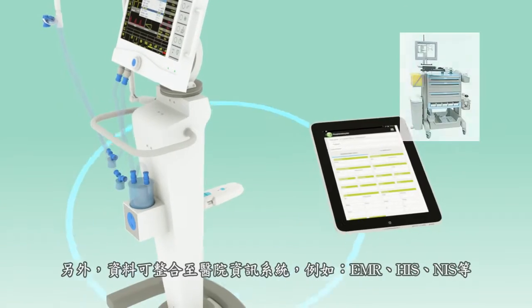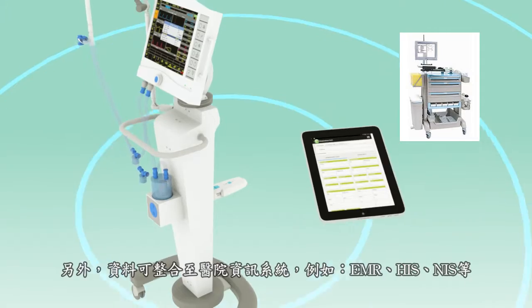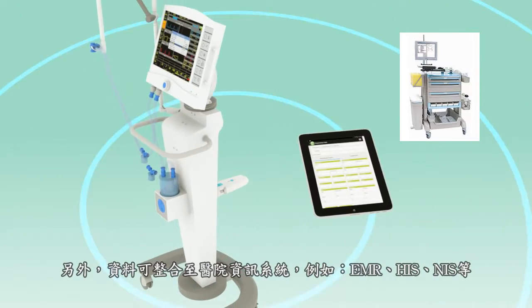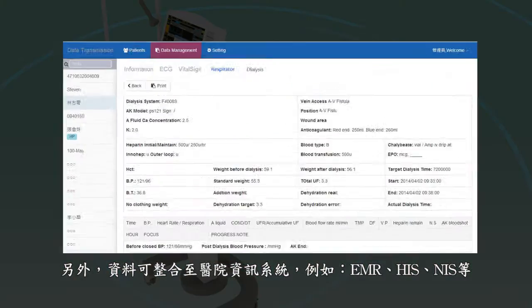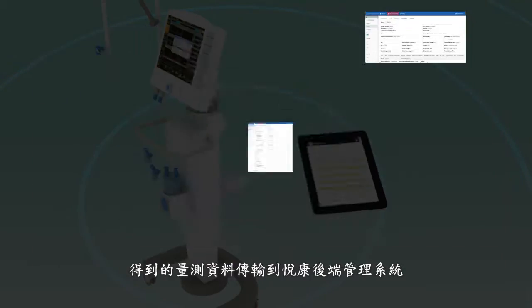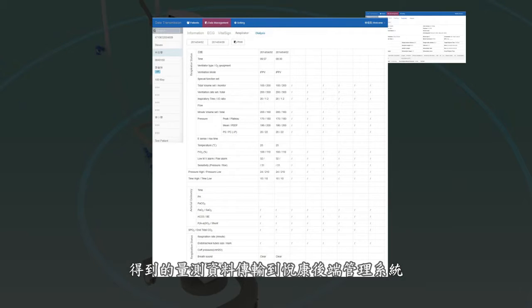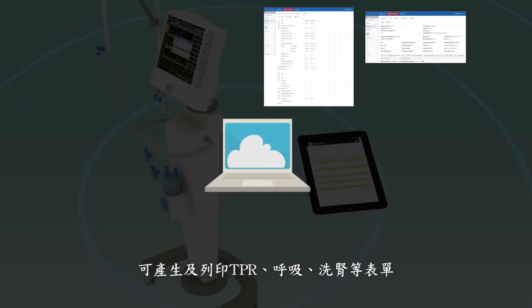All data can be sent to intra-hospital systems such as EMR, HIS, or NIS, or to Uekong Management System for reporting and printing needs.